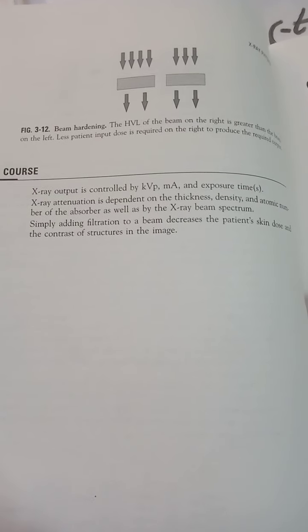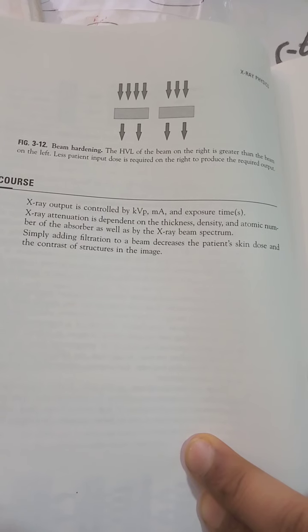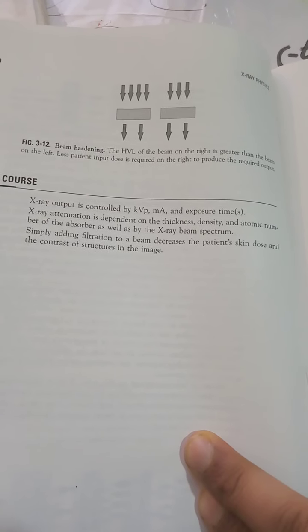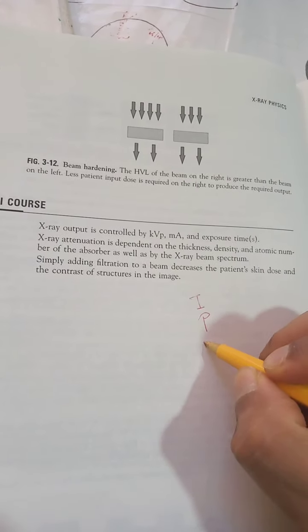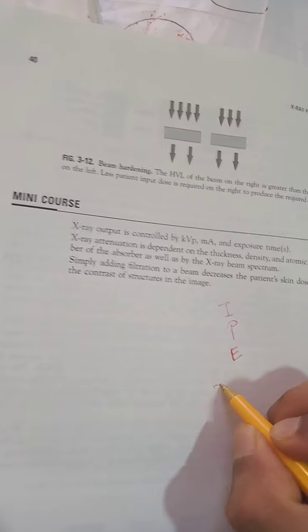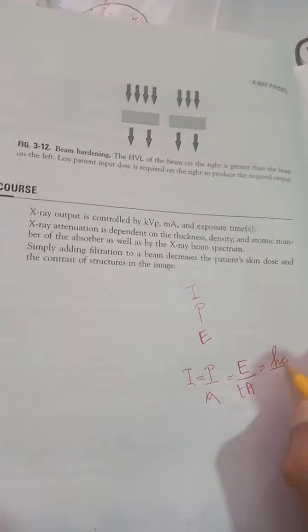Now, the summary for this chapter. X-ray output is controlled by voltage, current, and exposure time. X-ray attenuation depends upon thickness, density, atomic number Z, as well as the X-ray beam spectra. It depends on intensity, power, energy, and the formula I wrote earlier. So that's how it is.